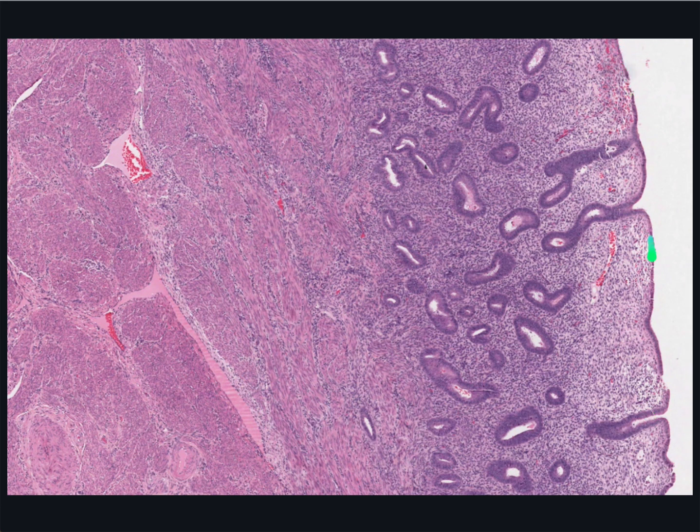But, as mentioned in the previous image, the epithelium of these basal glands will proliferate and replace the lost epithelial surface. You can actually see this happening in these small areas here, and again imagine these epithelial cells migrating from these two glands in these two regions.